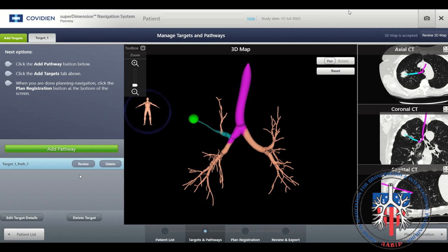In this screen you can add another target or pathway, edit target details, or delete the current target.